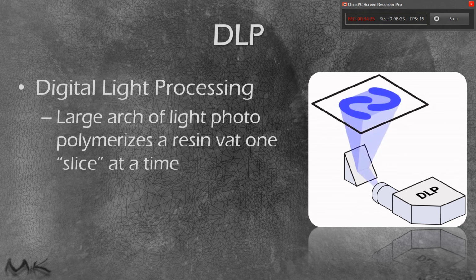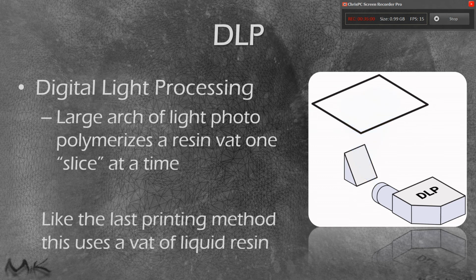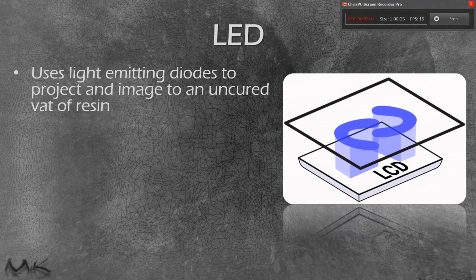So instead of following an individual path, it's going to divide your 3D printed product into different layers, or one slice at a time. It's nice because DLP can typically have a larger build platform, and every layer or slice is what matters, not how many passes the laser has to make. So these tend to print very, very fast. Things like Moonray and Sprint Ray printers can print very quickly, and they tend to be very low maintenance because there's not a lot of moving parts. Again, it still cures a liquid vat of resin.